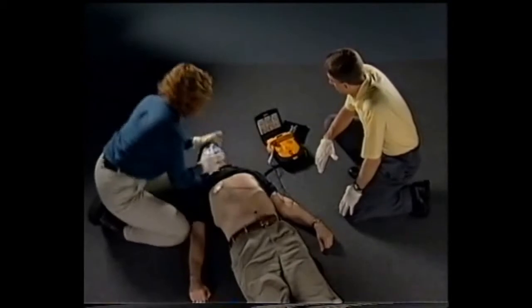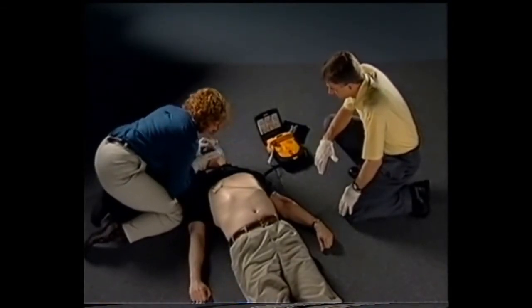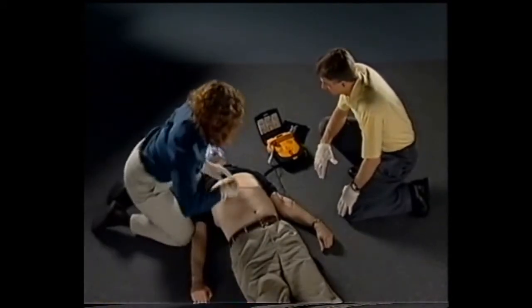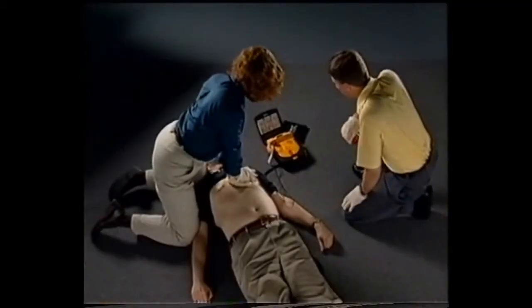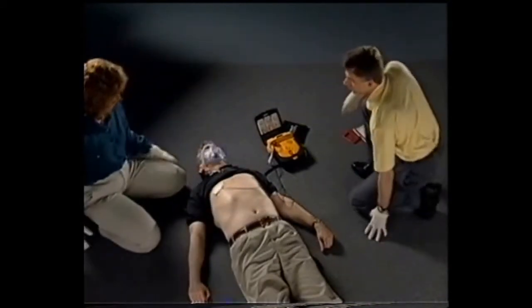Motion detection is a Medtronic Physio-Control patented feature. It is designed to protect a rescuer from receiving a shock and to prevent the defibrillator from evaluating the heart rhythm when the patient is being moved, for example during CPR. If the defibrillator detects motion, you hear, "Motion detected. Stop motion." You need to stop touching the patient.